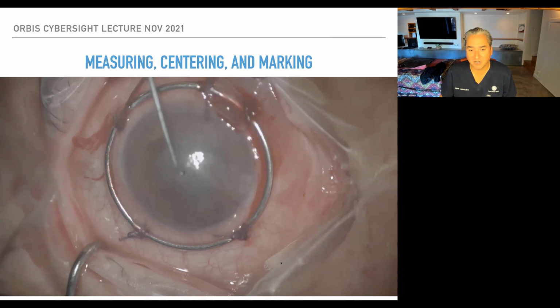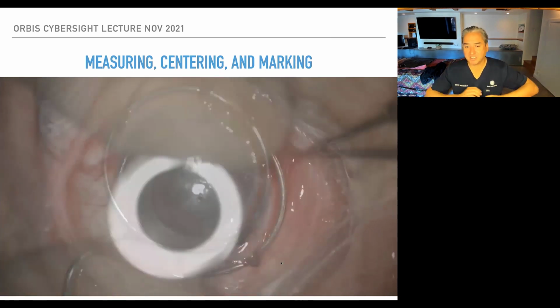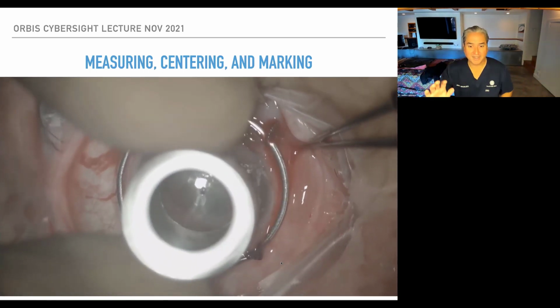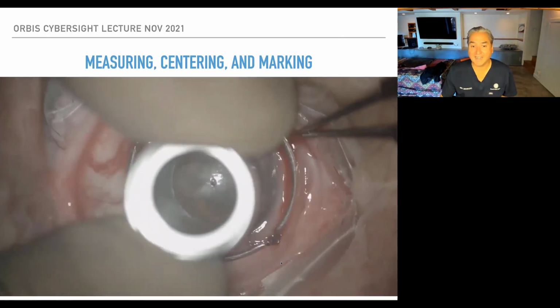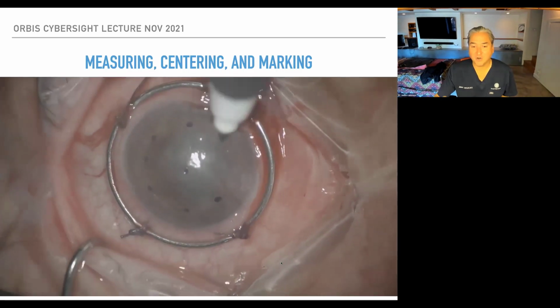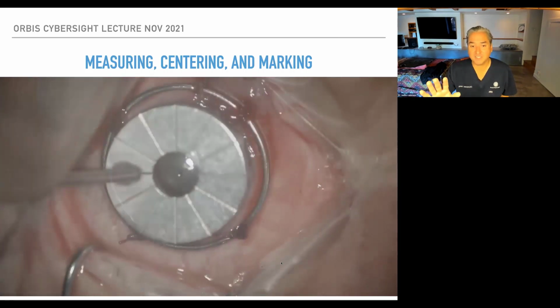And I mark the center with a Sinskey hook, and this is the geometric center of the cornea. This is not the pupil, okay? And then I put a 7.5 trephine on there, and I make sure that's centered by rotating the eye around a little bit. And then I mark the epithelium, and then I can use a marking pen. Now, you don't have to do all this. You can just mark the center, but I did this for illustration. This helps you to center the best.